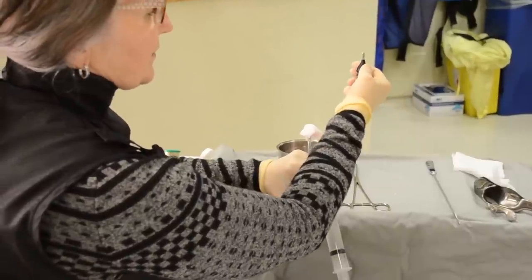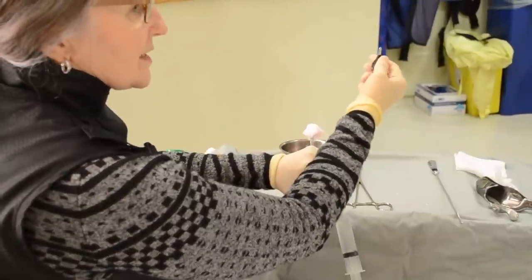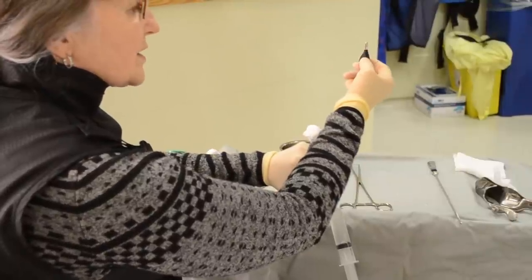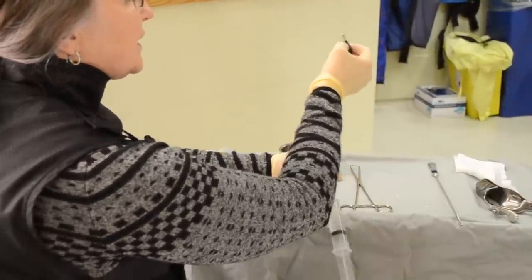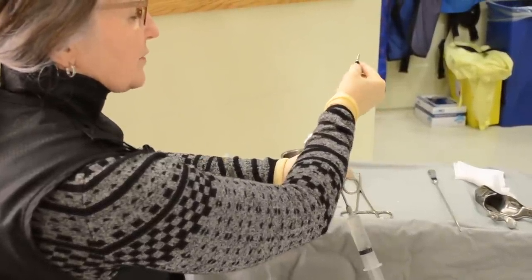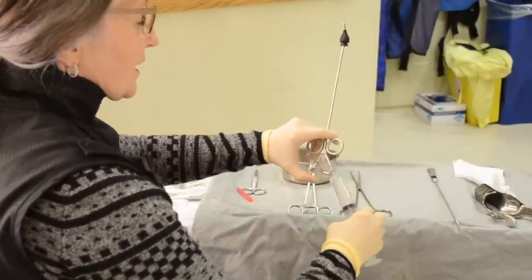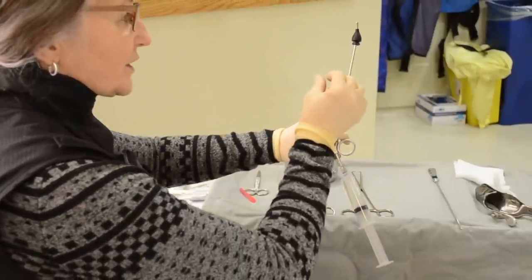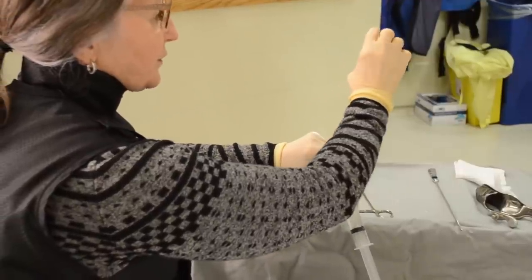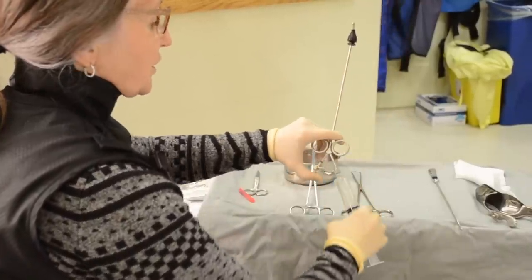This rubber stopper has now been replaced primarily with silicone, so they tend to not be as malleable as this — I like this one. There are holes on the side of the cannula, and I want this to be just enough to get inside but not enough to obliterate the side of the uterine cavity. Often times the cervix is quite patulous, particularly in some secondary infertility cases, so I would rather not have too much of the cannula potentially going inside.